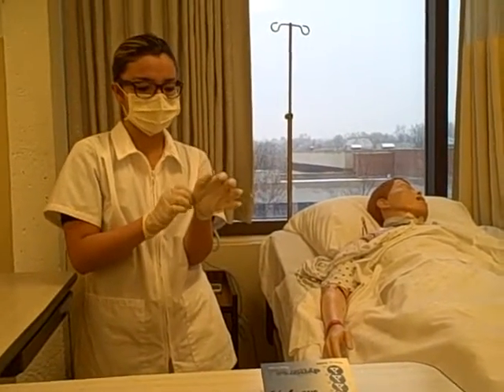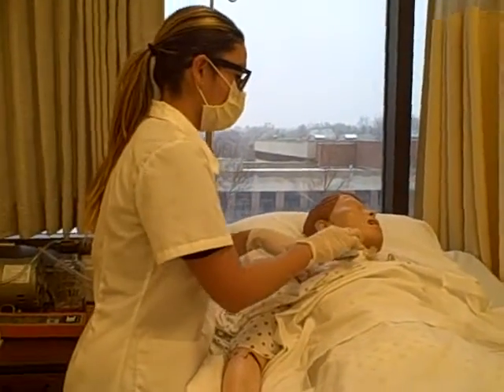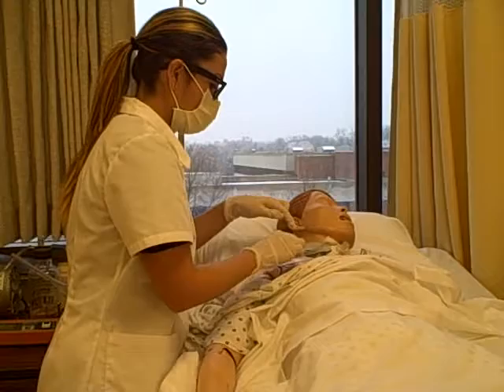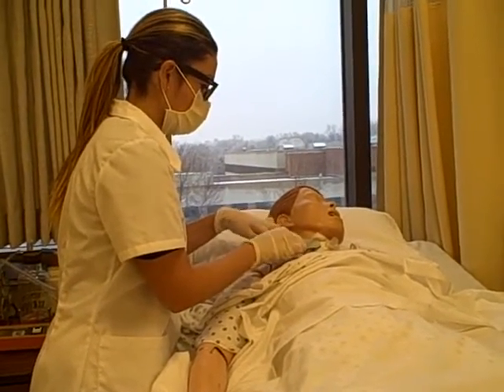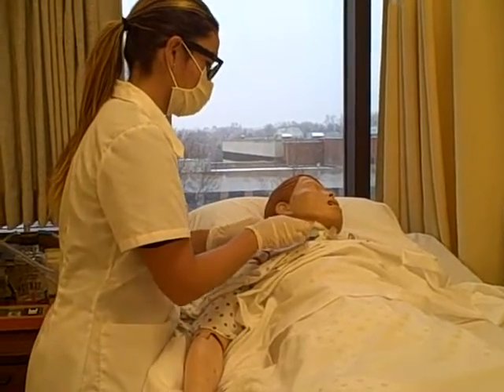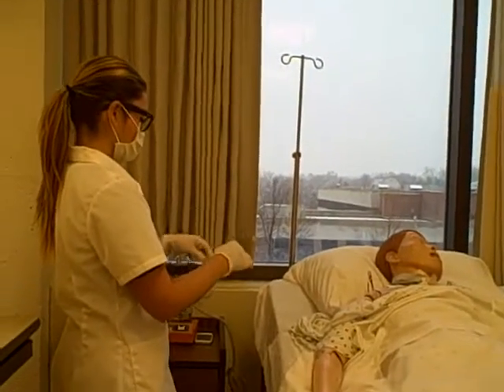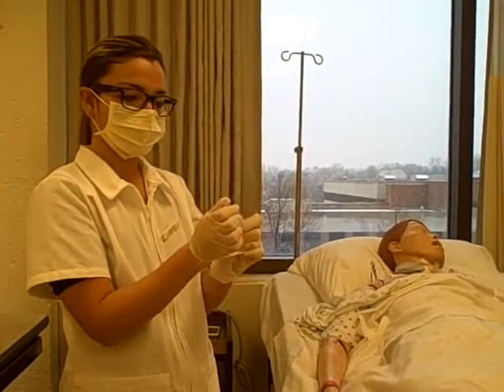So once our gloves are on, we're going to get rid of the old dressing. So we're going to pull slightly from the edges so we don't hurt the patient. Down towards the surgical site. Just very careful so we don't move the port at all. Okay. So we can go ahead and dispose of the old dressing. And we can go ahead and dispose of our old gloves.